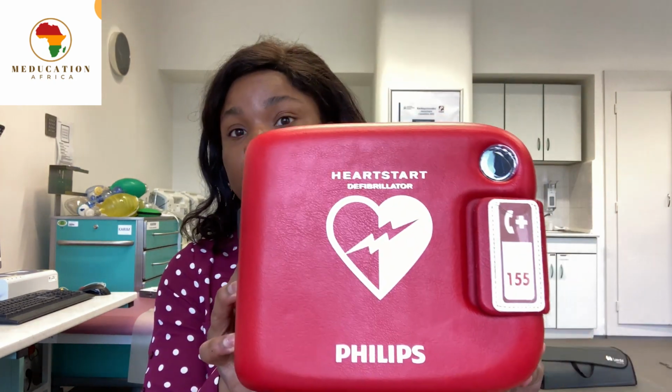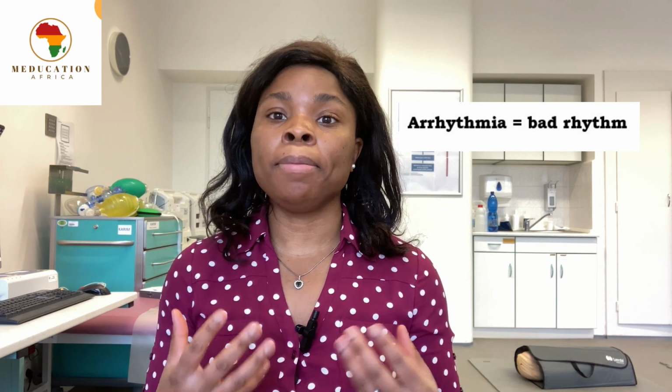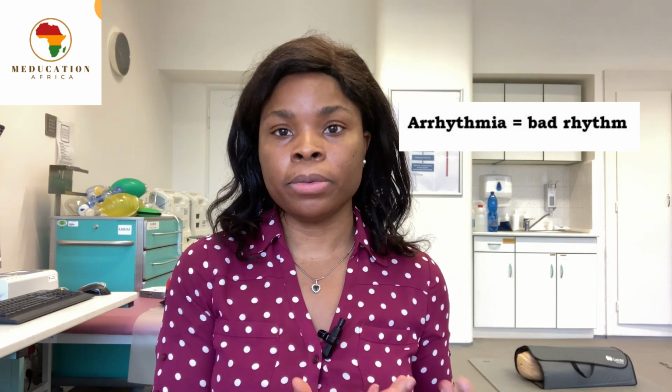So why does a heart stop pumping? There are many reasons why a person's heart can stop pumping, but one of the main reasons that a heart stops pumping, and why an AED is often used, is due to an arrhythmia. Arrhythmia means that the heart is not beating to its normal, regular rhythm.